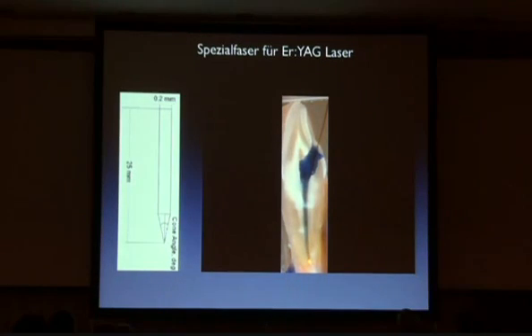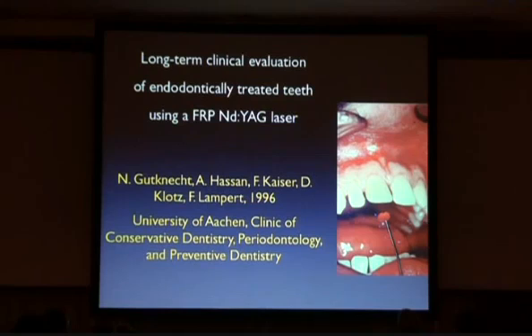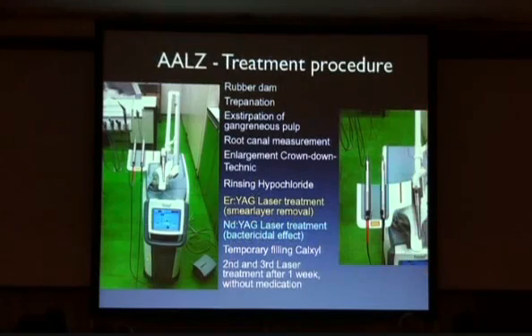And of course, we have been investigating how it is possible to use this method in a long-term study, a follow-up study of 5 years, to see how big and how good our success rate is. So long-term clinical studies have also been done, with a very clear treatment concept. As you can see here, the treatment concept which we have established includes, of course, all the conventional treatment, and after the conventional treatment is completed, before filling the root canals, and/or in between, we are using wavelengths, either combining Erbium-YAG and Nd-YAG or only Nd-YAG lasers, in order to clear and remove and destroy all the microorganisms in the root canal system.